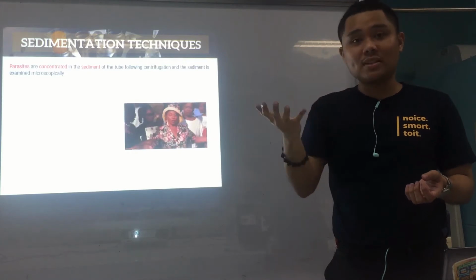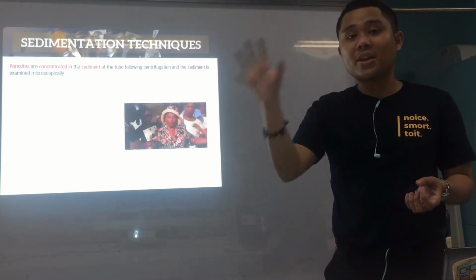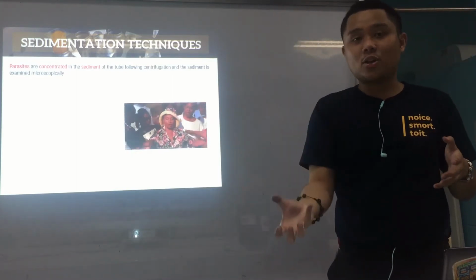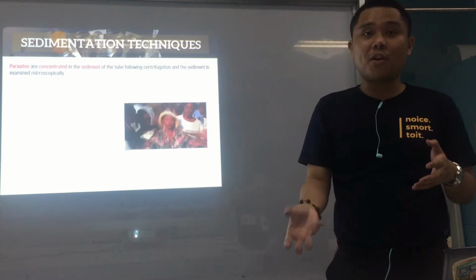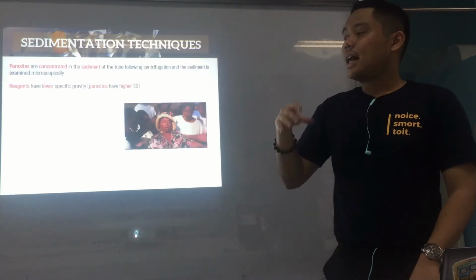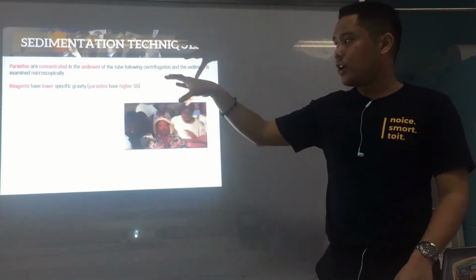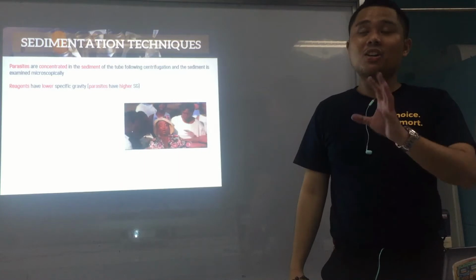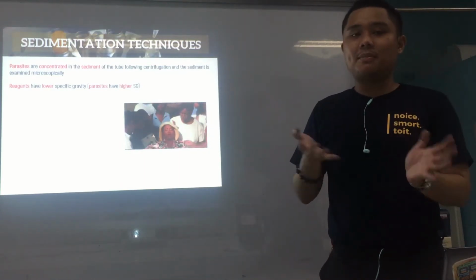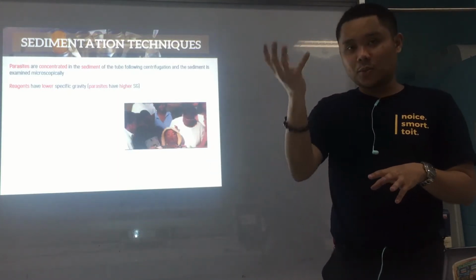Because again, the rationale is that the parasites are much heavier this time than the reagents used, therefore they settle at the bottom. We then recover them from the sediment after centrifugation. The reagents have lower specific gravity, and the parasites have higher specific gravity, meaning they are denser and heavier, so they will sink.